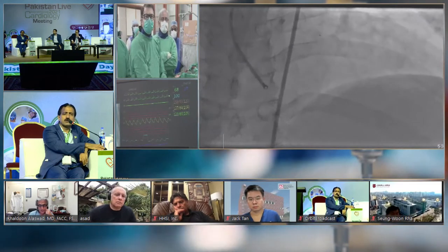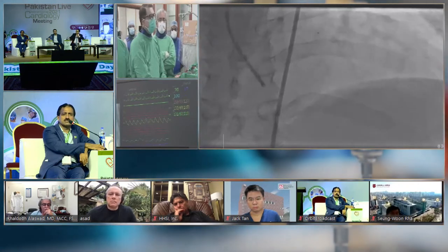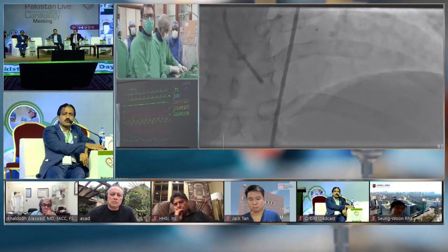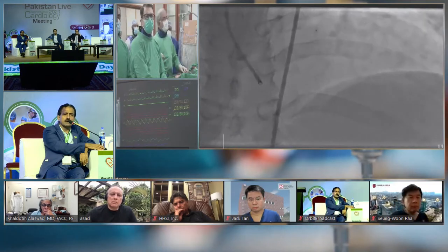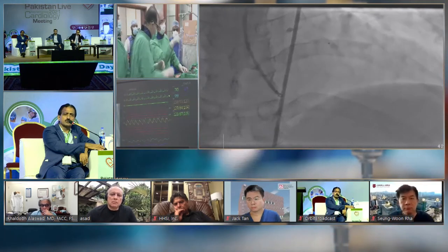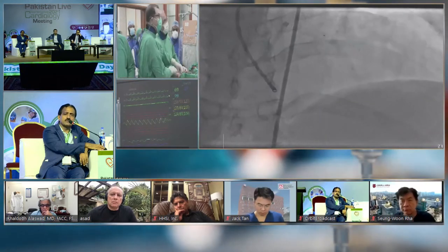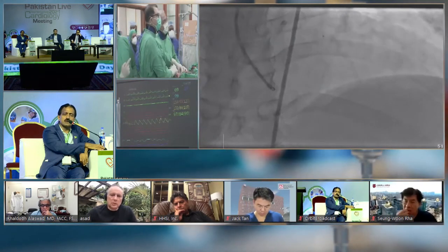Sohail, can we just stop for a second? I would like to ask the panelists what would be their first wire choice in this case. We have Dr. Mehboob Alam from Baylor. Mehboob, what would you be choosing? What kind of wire in this case would be your first choice as a starting wire?